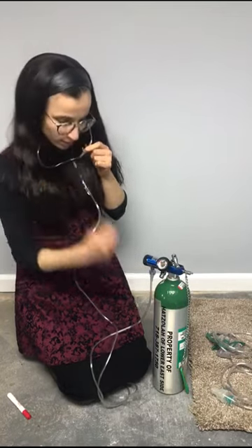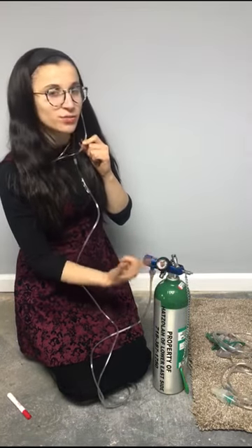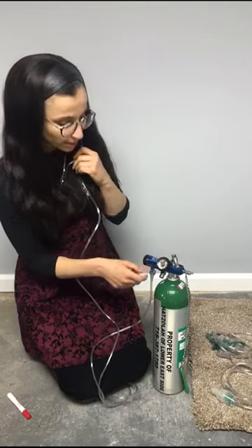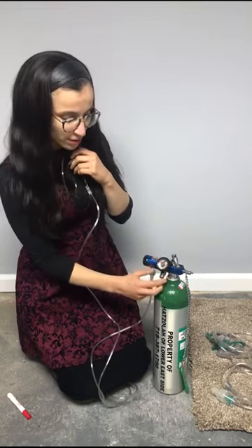And then here's the oxygen. You always want to make sure it's full, because you don't want to be transporting a patient and then it's off. I had that once. I transported a patient and they didn't realize it was empty and the patient turned blue. We were trying to figure out what happened and then we checked and it was empty. So always make sure it's full or at least half full, depending how far you're transporting the patient.